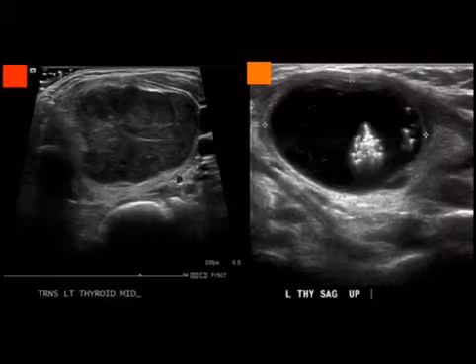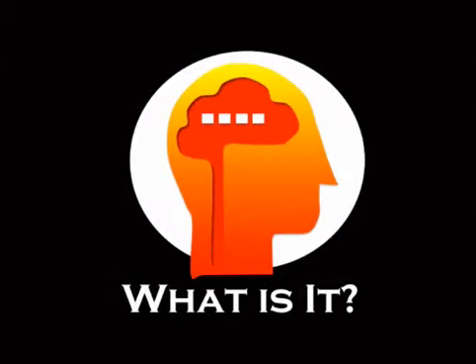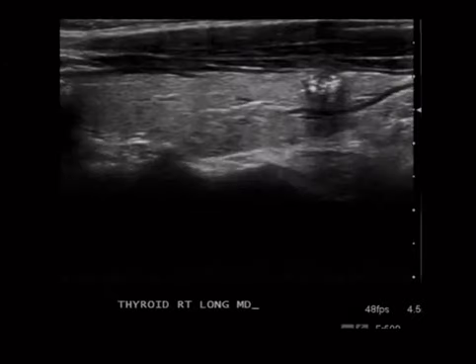So looking back at these two nodules, the one in the red would get a needle, and the one in the orange would have to let that go. Here's a next case, another grayscale thyroid image, and with a zoom up you can see that this one has microcalcifications. And even though it's not very big, it's going to get a biopsy because, remember, that is the number one criteria. Microcalcifications, number one. Solid versus cystic, solid number 2, size number 3.